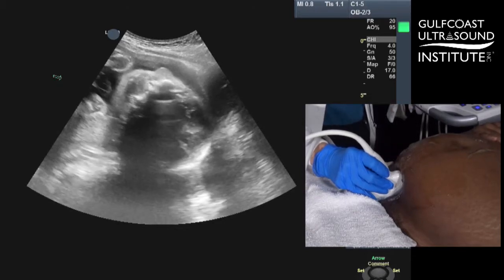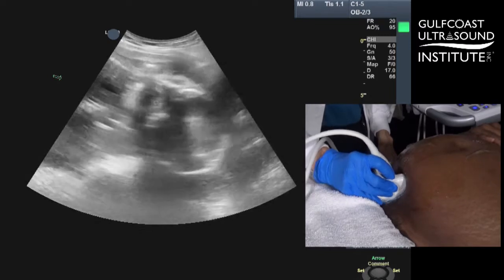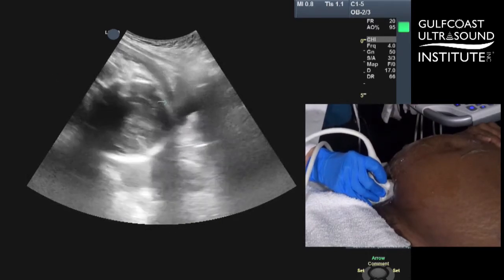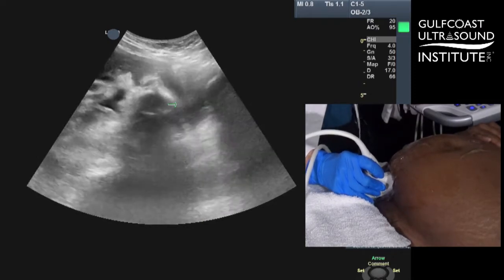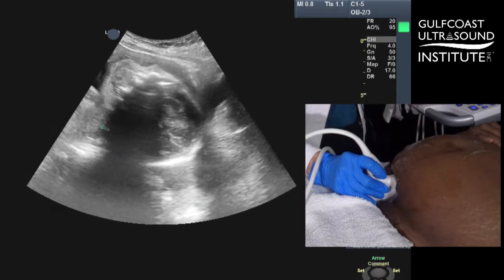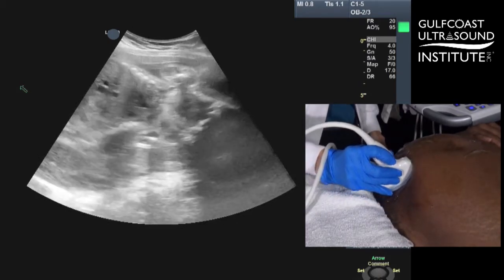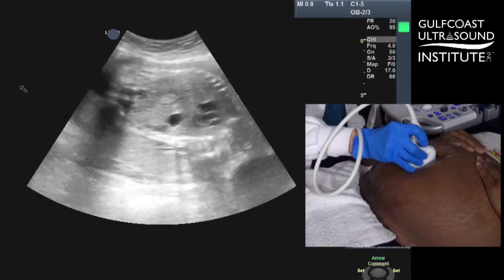When you start your OB exam, take your transducer in a longitudinal fashion down low towards your patient's symphysis pubis. We're going to start there and already you can see the patient's bladder partially full. You've got the patient's fetal head down low, and now we're going to do a quick maneuver in a longitudinal fashion, just sliding up mom's abdomen going high in the uterus right down the midline of her abdomen.